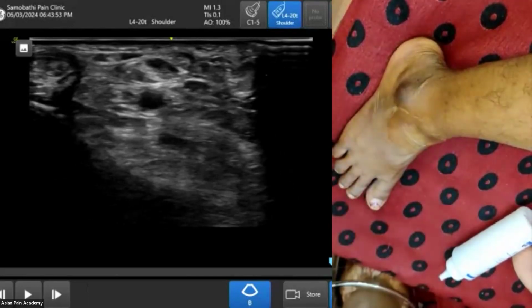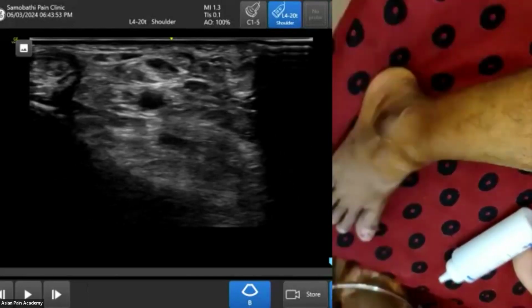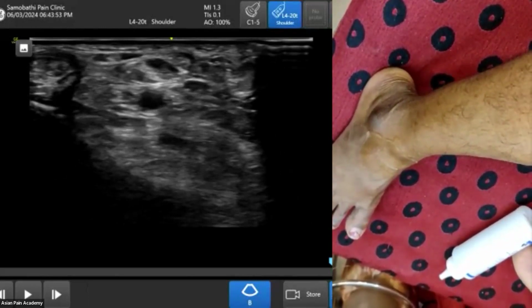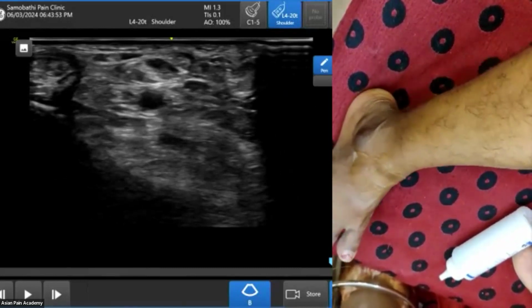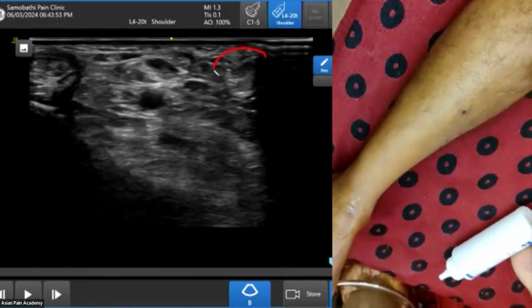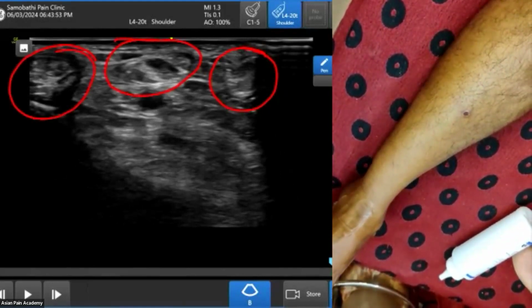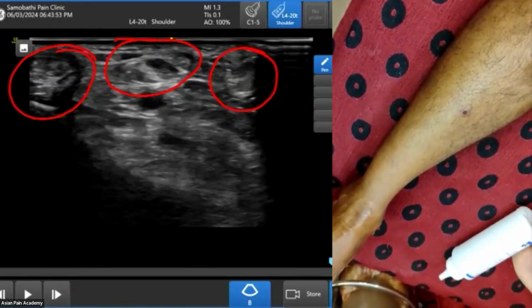Okay. So here with the scribble pen, here also first, second, third. This is the first tendon, this is the second tendon area, and this is the third tendon area. Remember, white part is tendon, black part is remaining muscle. More distally I will go, it will become totally white and tendon. But a bit more proximally, there is some muscle fiber. So over the talus in this area, it is common to see both black and white, muscle and tendon.